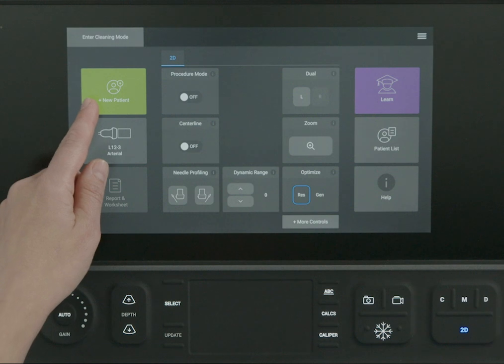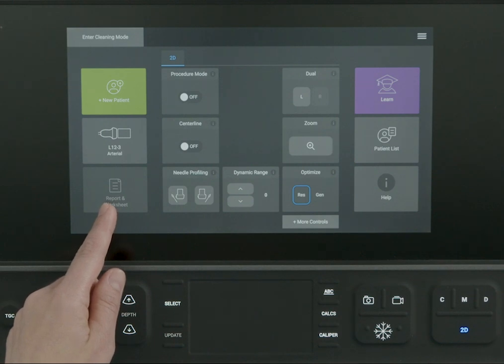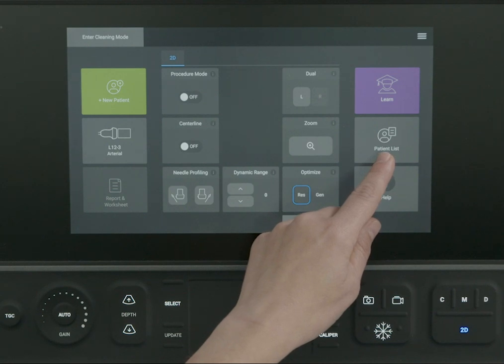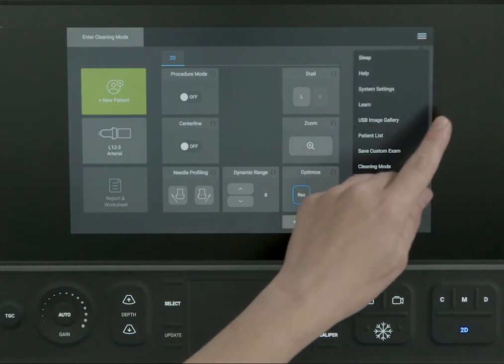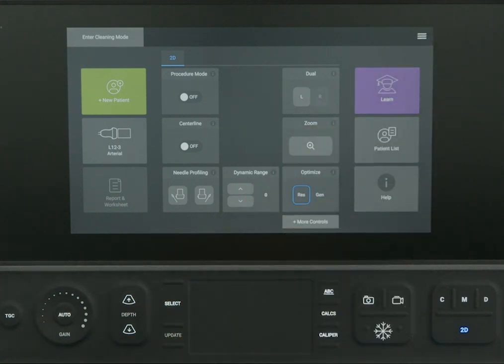You can enter patient information, choose a transducer and exam type, view reports and worksheets, navigate to the learn feature to view videos, use the patient list to view previous studies, and access onboard help. From the touch panel, you can also freeze the system controls before cleaning. System settings and other features are found under the system menu.